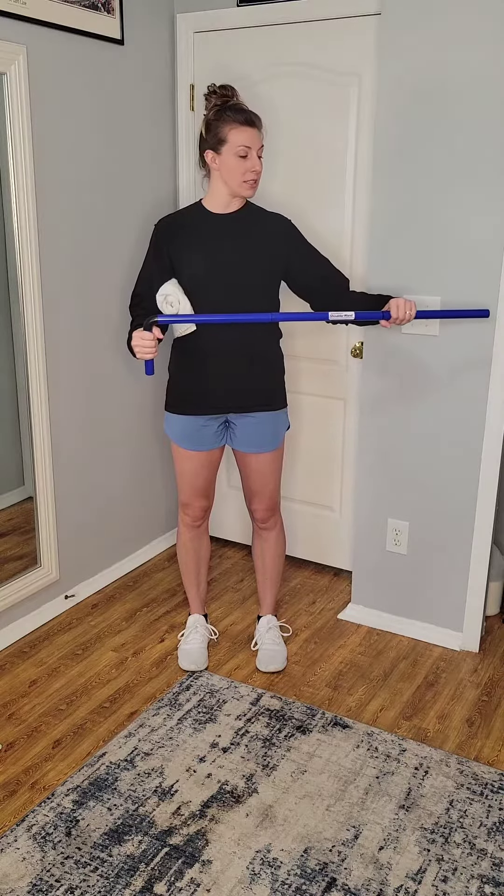Your opposite side, which is the stronger one, can hold the wand somewhere along the body of the wand, or it can hold on the end — totally up to you. It's just whatever feels comfortable, because that side is the one that's going to assist the opposite side.